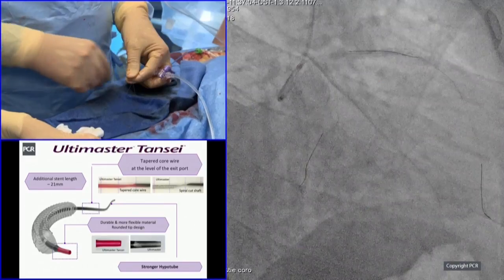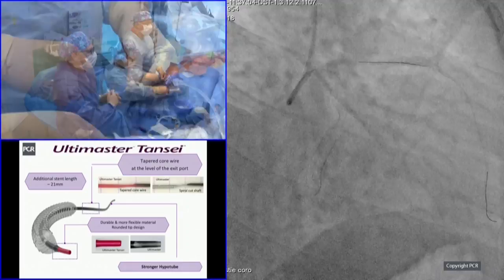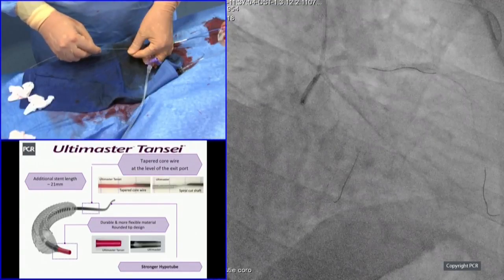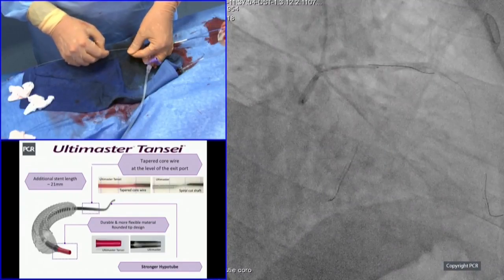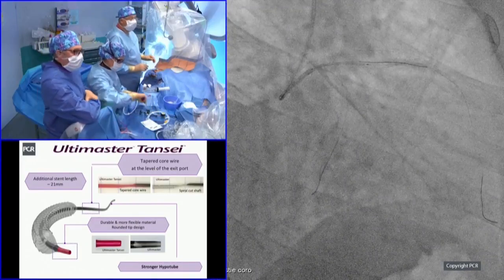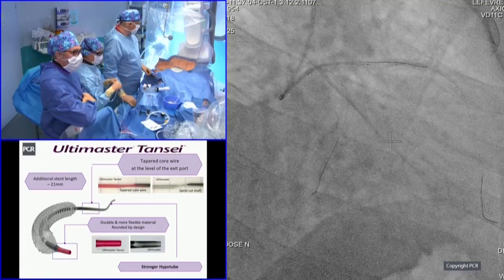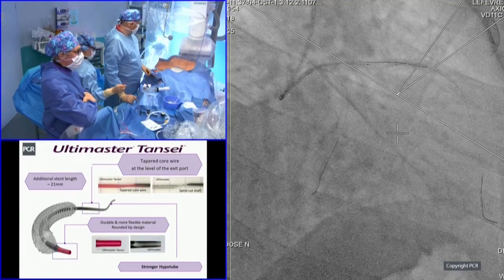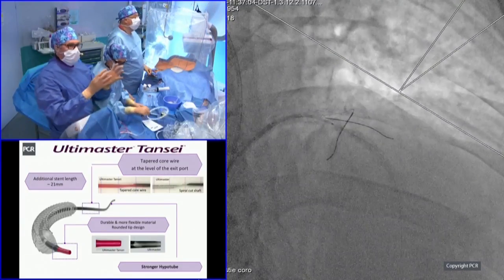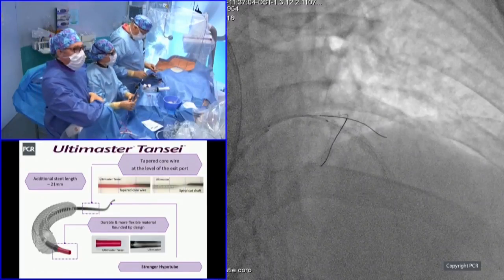We had a question from the audience: why don't you use a stent only on the proximal LAD and leave the left main alone? Yes, because we are not so precise. I like very much the idea of stent precision, but we are not so precise. This is the first reason. When you deploy a stent on the bench, you can see clearly that the stent is moving when you deploy. So it's very difficult to be very precise.